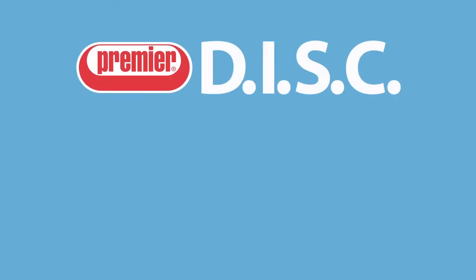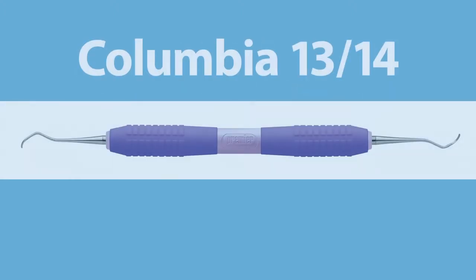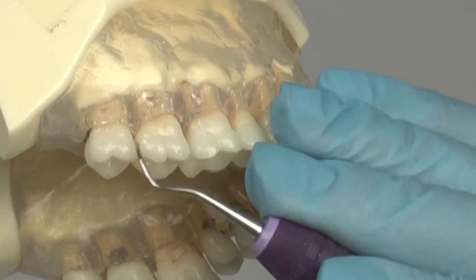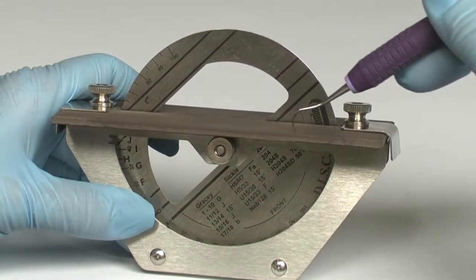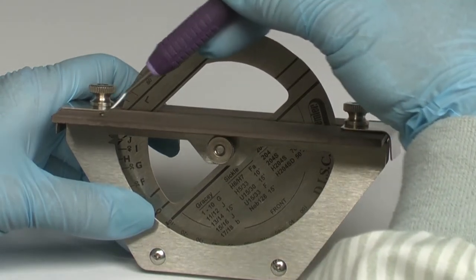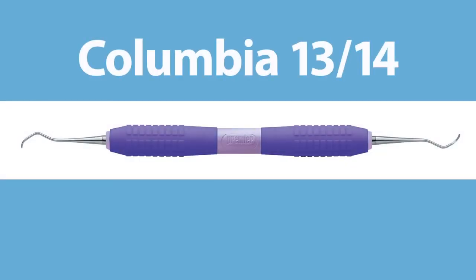Welcome to the Premier Disc video where you will learn how easy it is to sharpen the Columbia 1314 Universal Curette. We will review its intended use and the important parts of this instrument tip, as well as common problems to avoid in sharpening, and most importantly, just how easy it is to use the disc sharpener for predictable sharpening results every time.